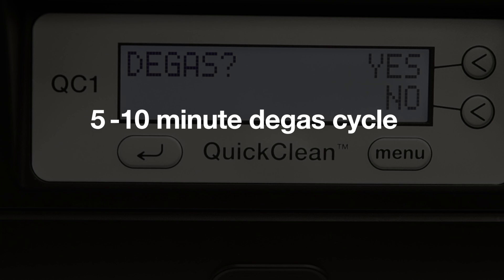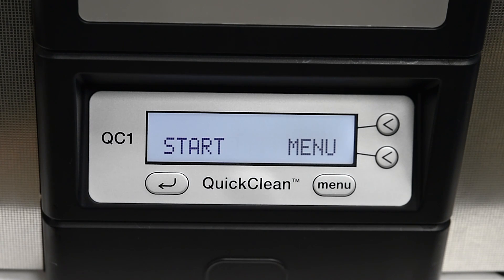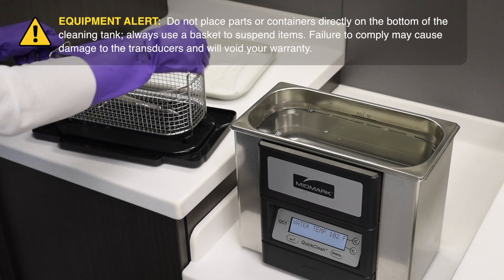After your de-gas cycle, or if you've skipped the de-gas cycle, the following screens will alternately appear. One shows the start menu keys and the other shows the liquid temperature. Your unit is now ready for cleaning.